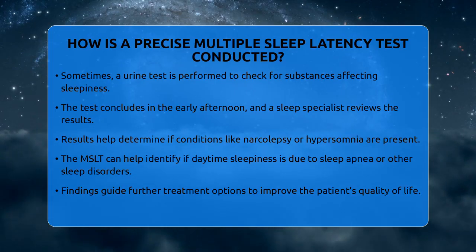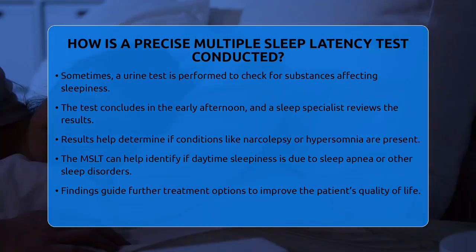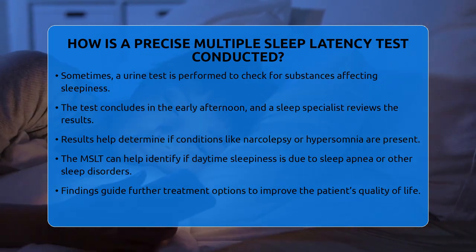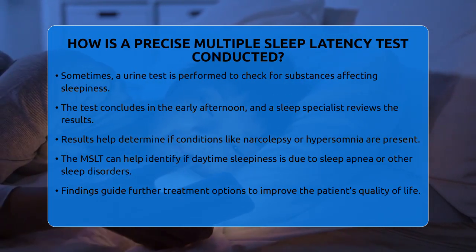A sleep specialist then reviews the results. They look at how long it took on average to fall asleep and whether REM sleep occurred quickly. These findings help determine if the sleepiness is caused by conditions like narcolepsy or idiopathic hypersomnia.